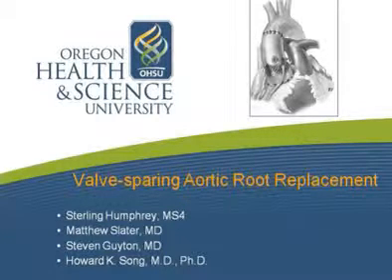This video presentation demonstrates the technique of valve-sparing aortic root replacement in a patient with aortic root aneurysm and bicuspid aortic valve. It is presented by the Division of Cardiothoracic Surgery at Oregon Health and Science University, Portland, Oregon.